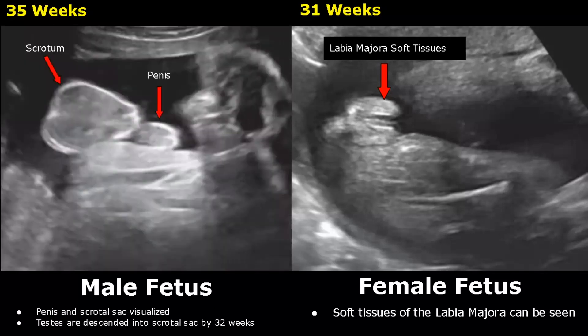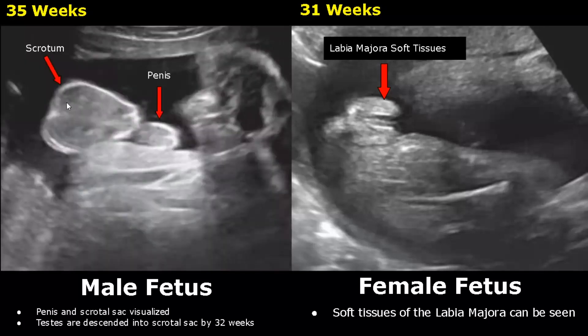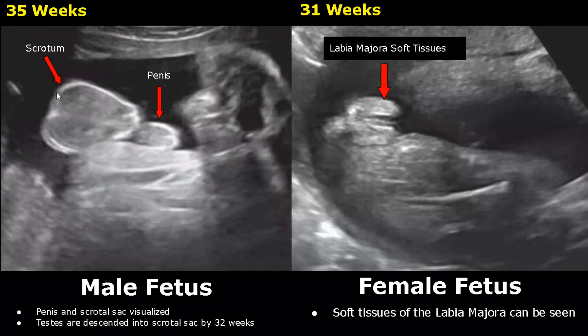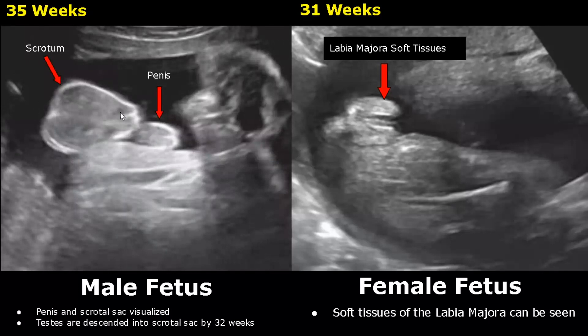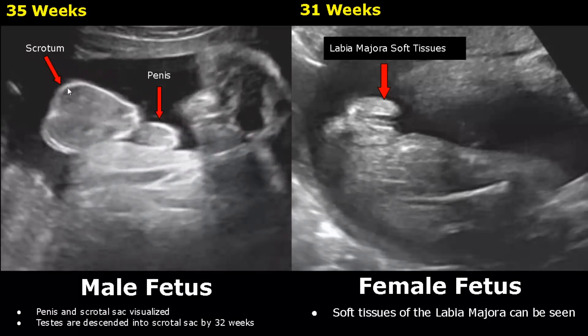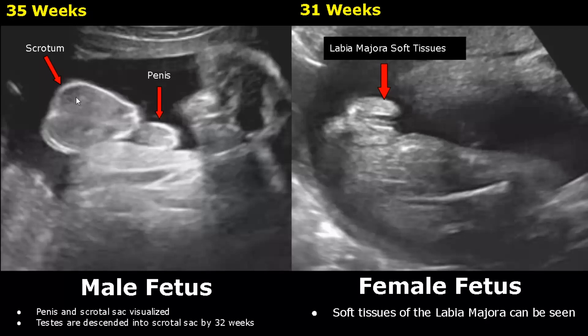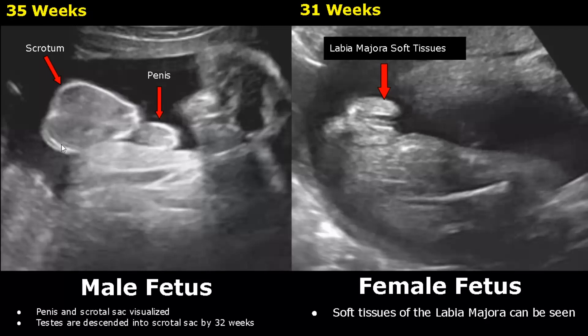Here is an image at 35 weeks. We can see the male genitalia very clearly. We can see the testes within the scrotal sac.